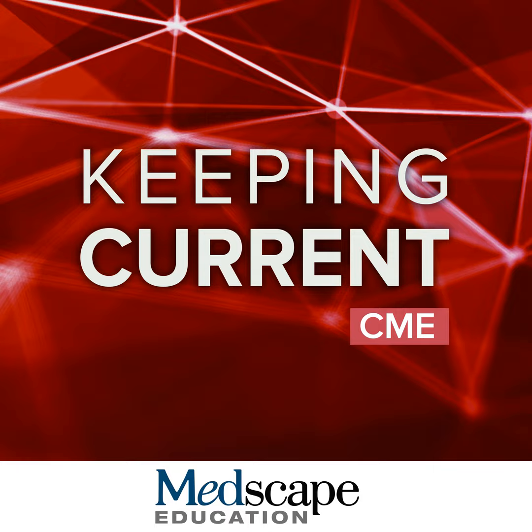However, the loss or decline of OATP expression, which is the molecule that handles gadoxetate uptake, begins to decline way earlier at the timing of dysplastic nodule. So between these two events, we have the collection of these nodules, which we term hepatobiliary phase hypointense nodules without arterial phase hyperenhancement. And you can see that both dysplastic nodules and early HCCs fall into this category.